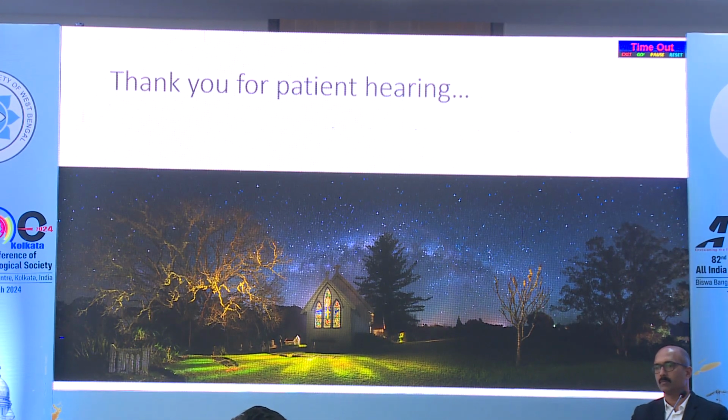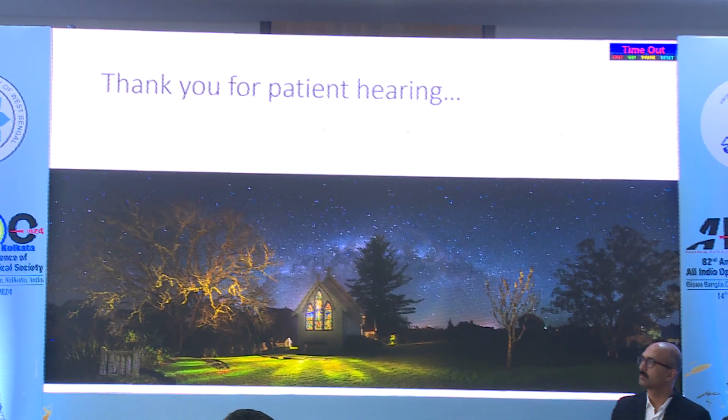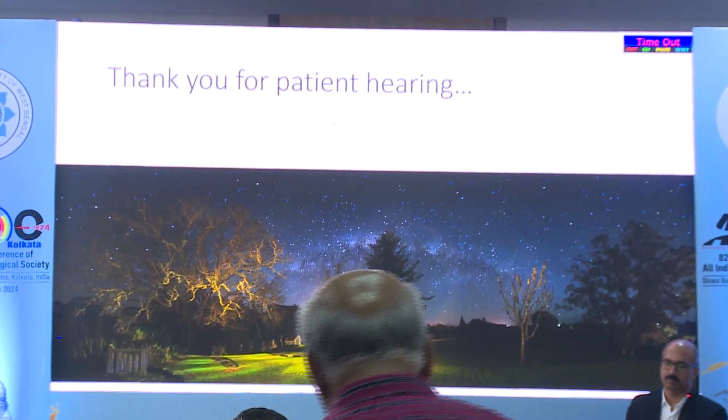So that's all. I think the widefield imaging is a very useful technique, especially for this kind of peripheral exudative chorioretinopathy as well as retinal vasculitis, to get a very good picture of the periphery, which otherwise you wouldn't have treated in many of these cases.